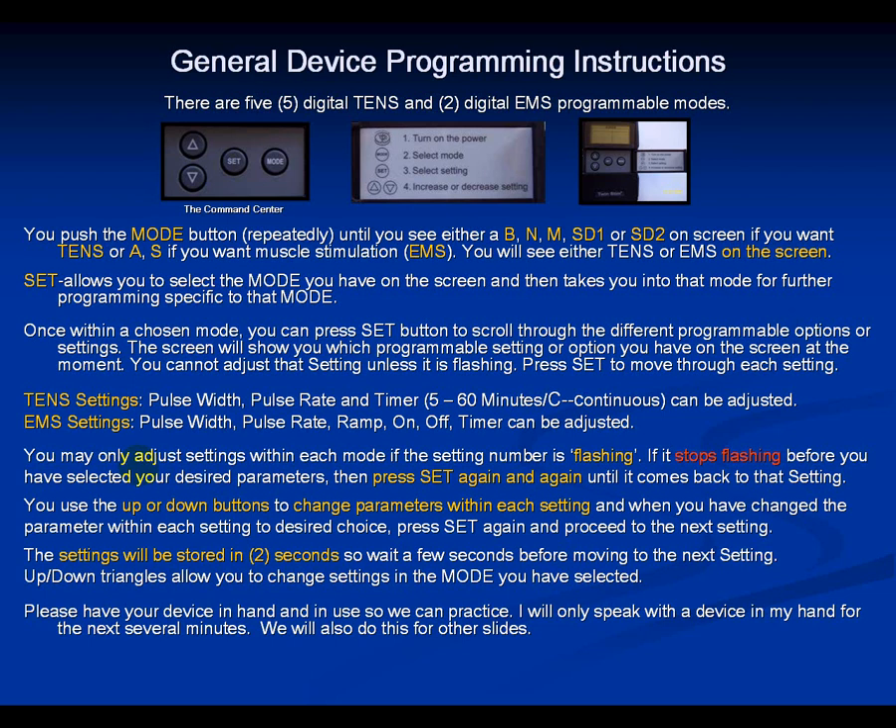Then hit set to get to pulse rate, and go down to 10. So we'll have a pulse rate of 10 and a pulse width of 150. Hit set again — now the timer is flashing. You'll see a little clock on the screen with the minutes number flashing. Set it to 20 minutes, then hit set. You've now set the pulse width, pulse rate, and timer.